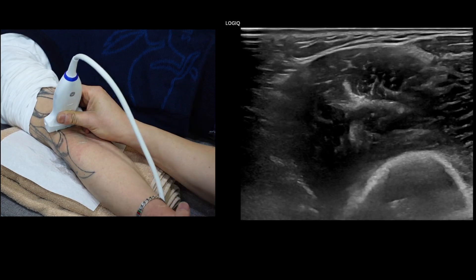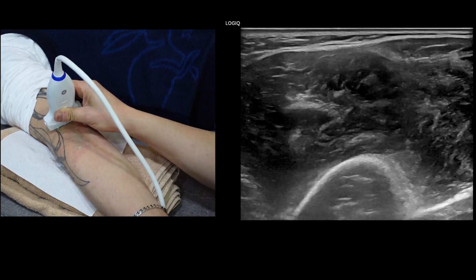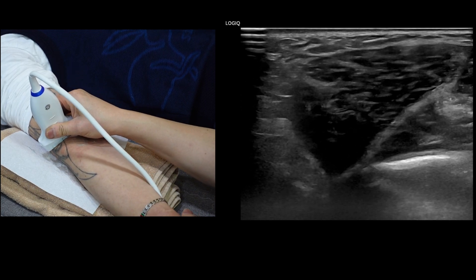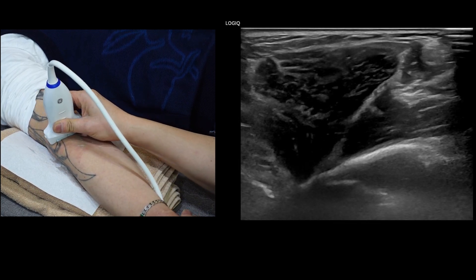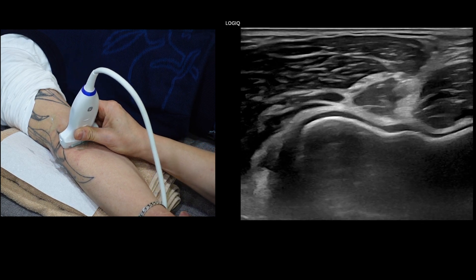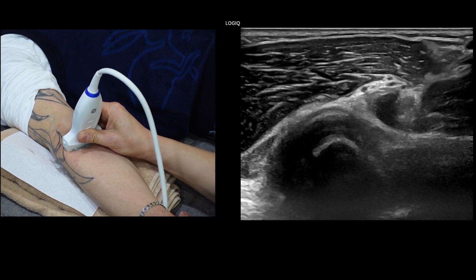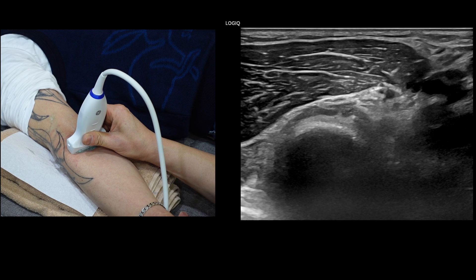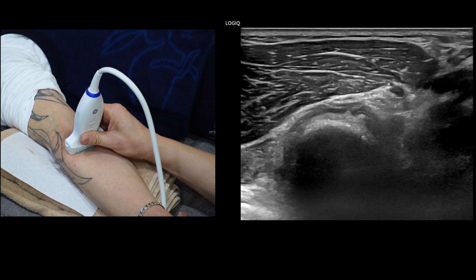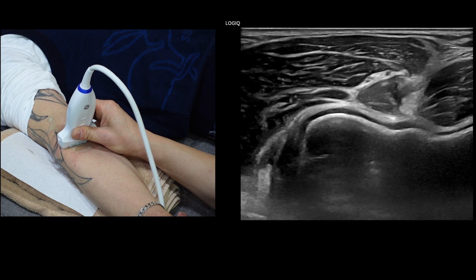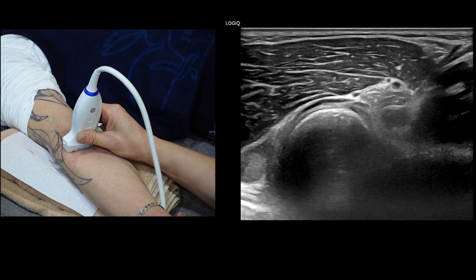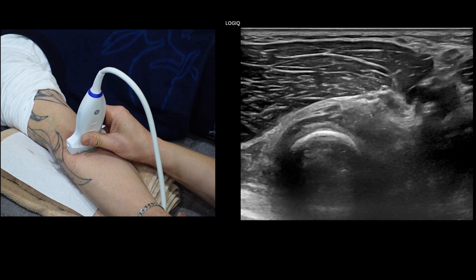We will then proceed to evaluate the deep radial nerve. The scan starts above the elbow crease, tracking the radial nerve in its intermuscular fascial plane between the brachialis and brachioradialis muscles. As we follow the radial nerve in a transverse scan, we will identify the separation of the superficial and deep radial nerves, focusing more on the deep radial nerve.